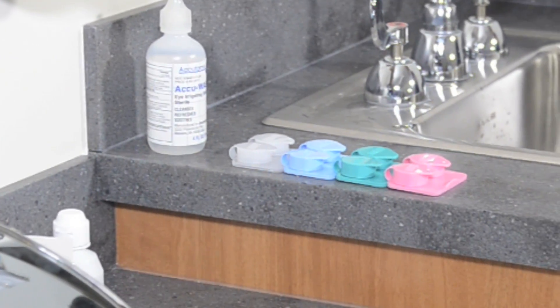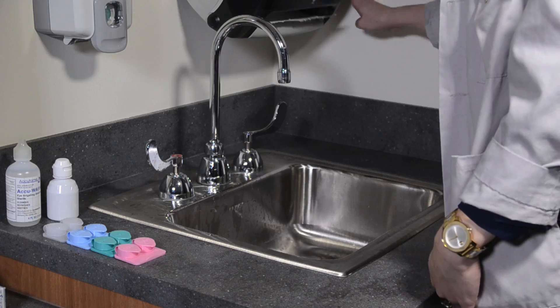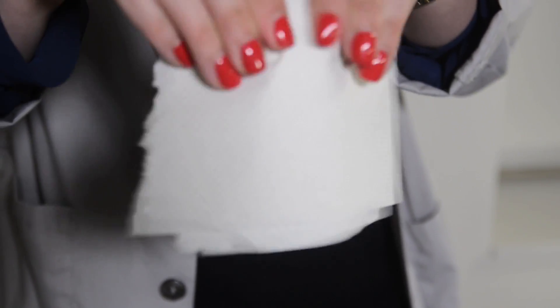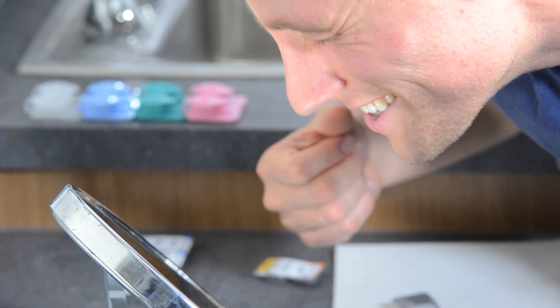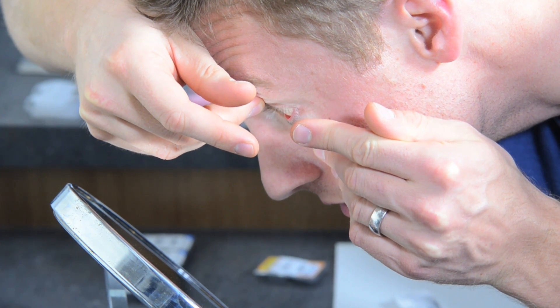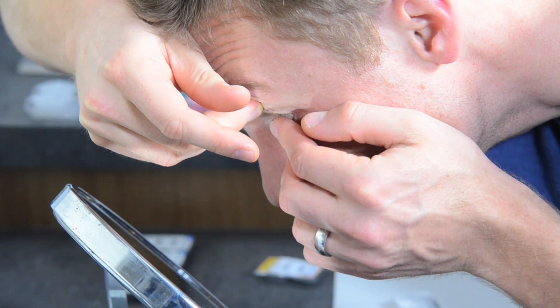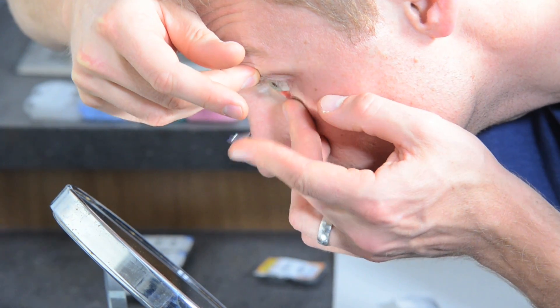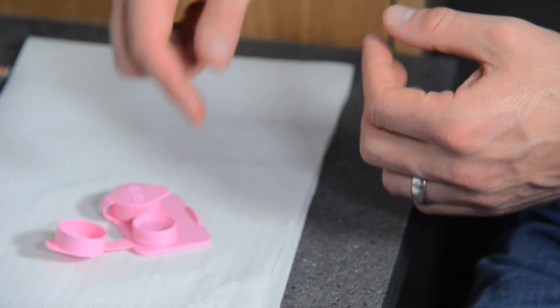Empty the case of solution, rinse, and place it upside down to dry. After reviewing insertion, teach them how to remove the lens — to me, this is the most important part. Often I'll let them leave with the lenses to practice as long as they're able to safely take them off. First, make sure you've placed fresh solution in the case and washed your hands thoroughly, and make sure your hands are well dried. Use the same technique as with insertion to hold your lashes and pull down on your lower lid. Look up and towards your nose and use your index finger to gently slide the lens onto the white part of the eye. Gently grasp the lens between your index finger and thumb in order to remove it. Clean the lens and place it into fresh solution.